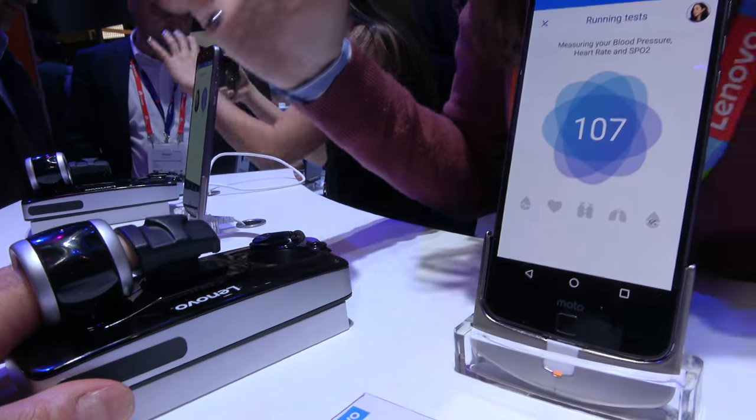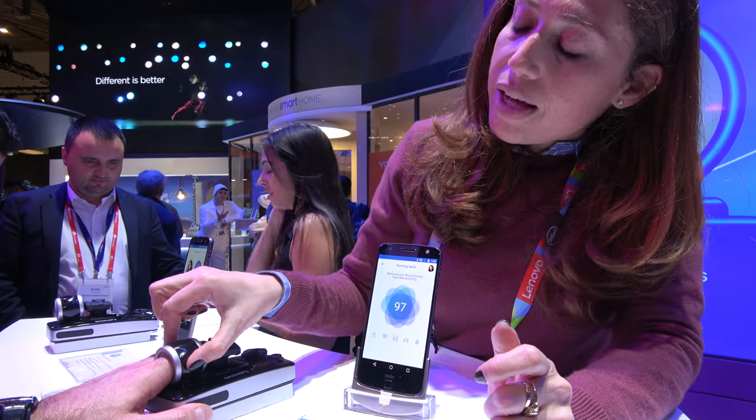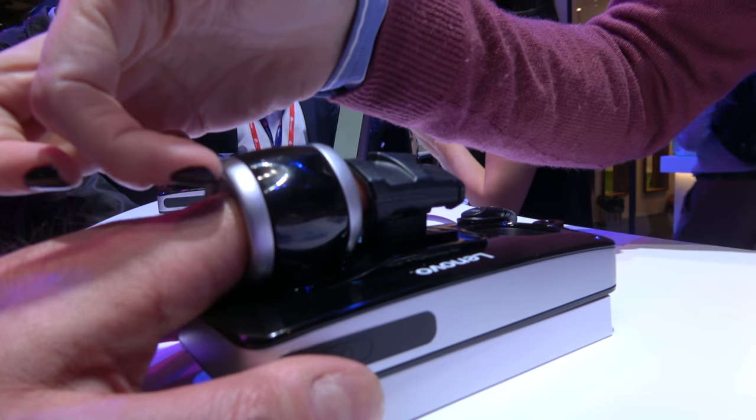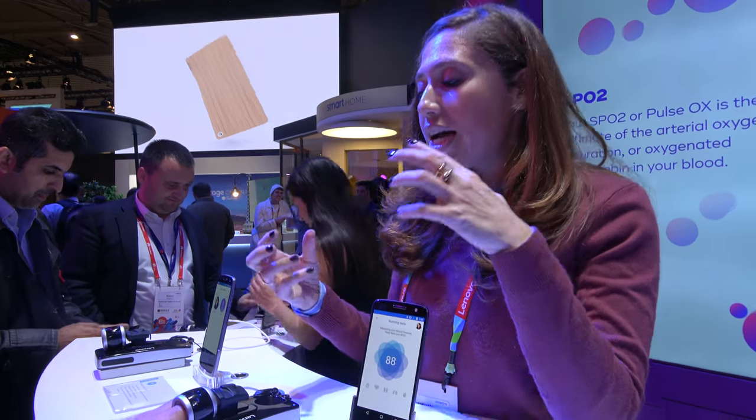The whole measurement to take the four vital sign measurements lasts about 110 seconds. What's happening is in this area of the device there's an inflation — an actual bladder that inflates around the finger and creates pressure and an occlusion, which is what allows us to then measure the blood flow.